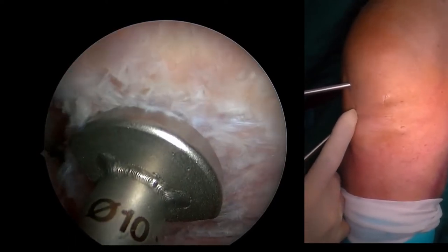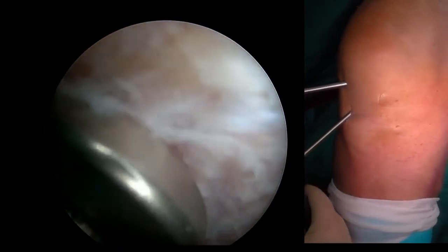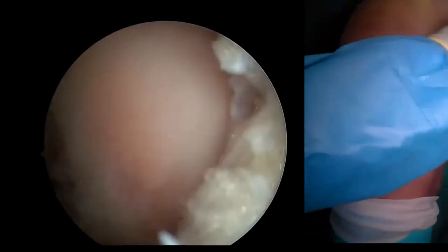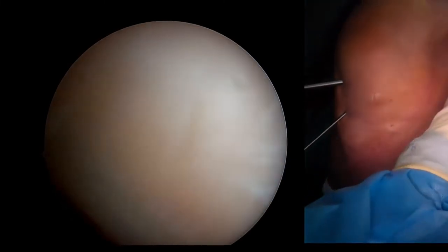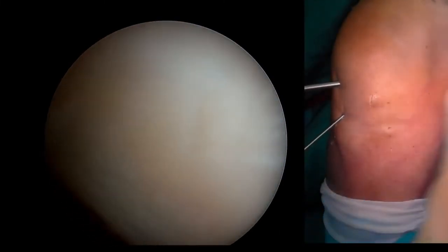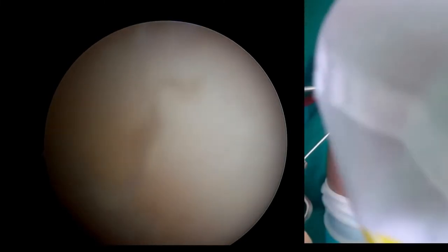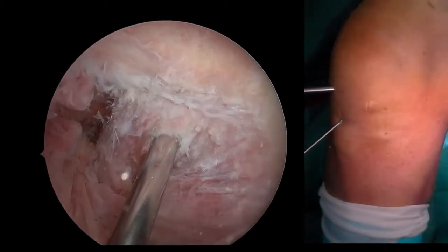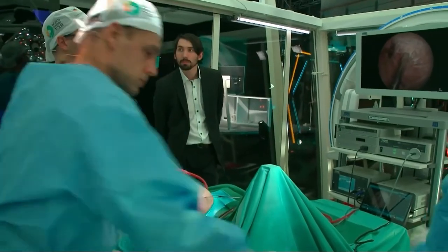Let's go — perfect. Yeah, all the way through. Can I have the drill again? I just want to drill it further out. I already know the diameter of the graft — I said I want to have a 10 millimeter wide graft. So I'm gonna drill a tunnel now with a matching diameter, 10 millimeters wide. I'm gonna take an interference screw fixation.